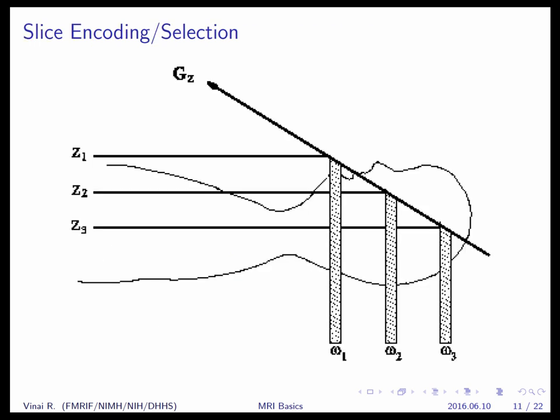So schematically, when the patient is lying in the scanner, and you apply a gradient along the imaging direction of Z, along the axis of the patient, so superior-inferior, the field that this slab of tissue sees is going to be a little bit higher than the slab of tissue up here in the brain. What you can do now is transmit at a slightly different frequency to excite, or push, the protons in this sample here into an excited state.